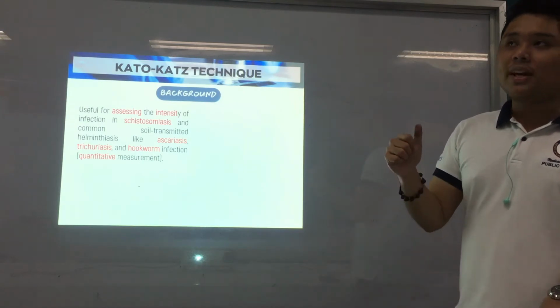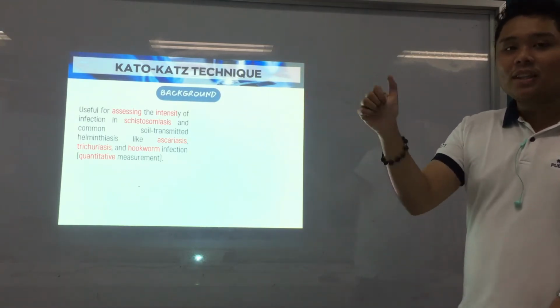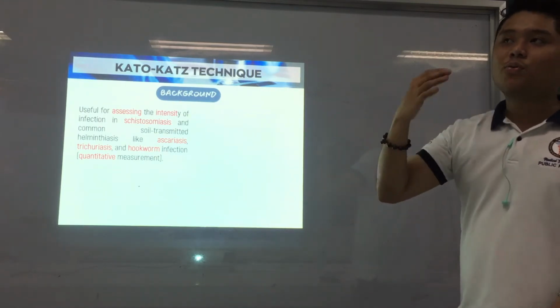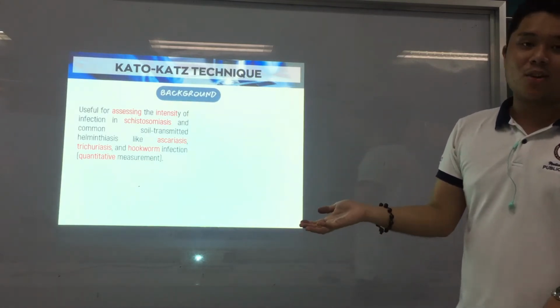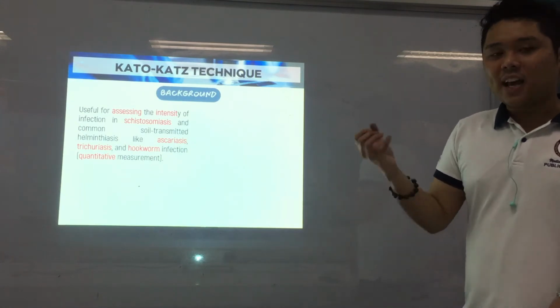So it's not only counting using the tally counter. We count the eggs, but we also solve. We have a computation to perform here. Again, we want to determine intensity, like how severe the infection is.